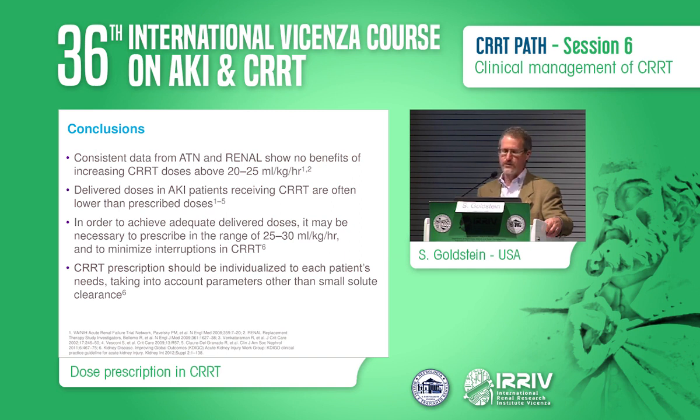Urea clearance is not the holy grail. It's not the only thing we should be paying attention to, but it is the first thing we should pay attention to.